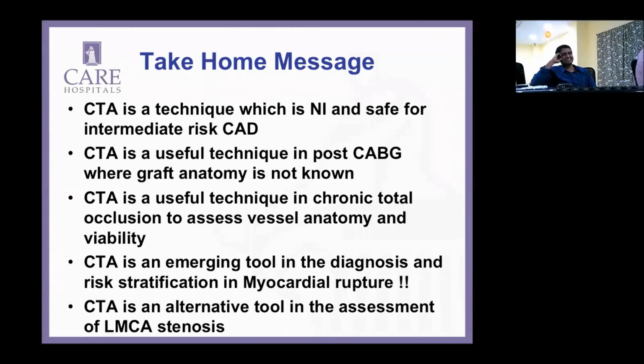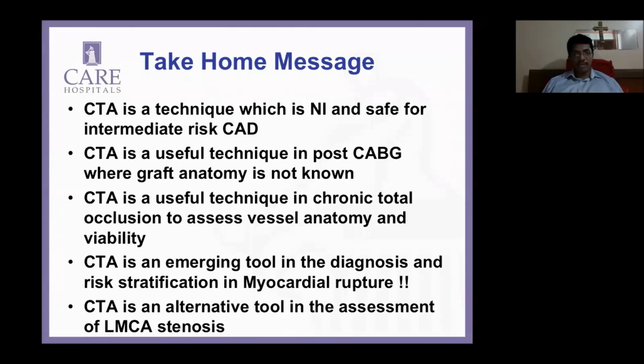And a traditional patient, not too obese, gets about 3.5, which I think is worth it for a diagnosis of CAD. In the long run, when you rule it out completely, the present data is almost 3 years for a non-smoker, non-diabetic, and maybe about 18 months to 2 years for a diabetic. The data on smokers is not very clear. I think it's worth the radiation to go through the whole scan.